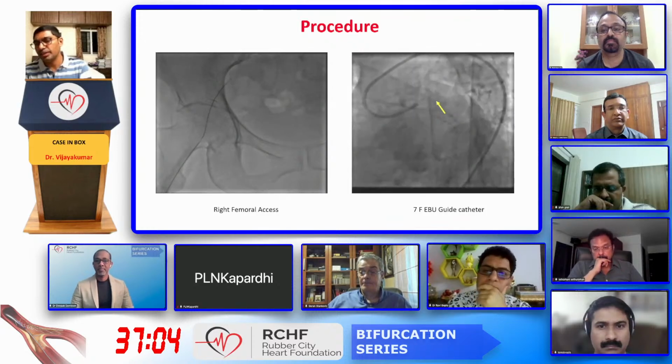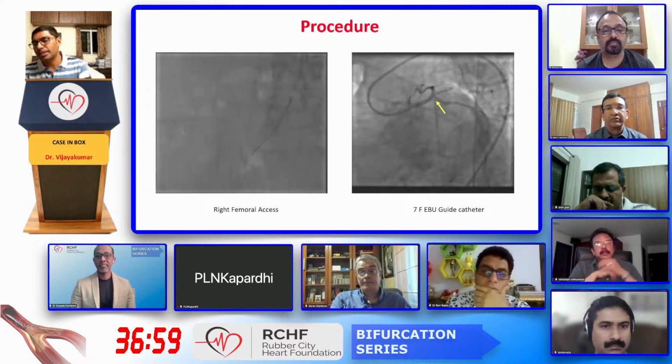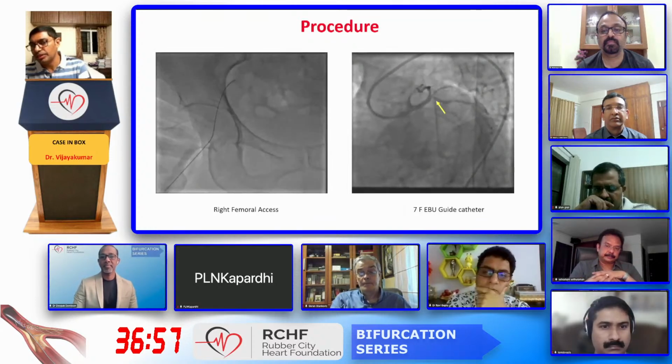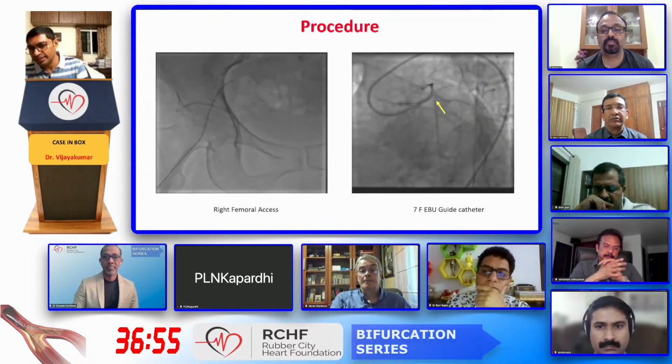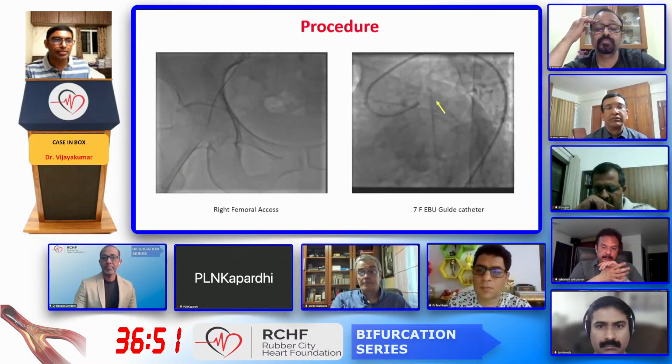This again, I didn't show earlier. You can see some haziness in the distal part of the left main and the proximal LCX. Can you appreciate the haziness here? Yes. Okay, I'll proceed if you're okay.